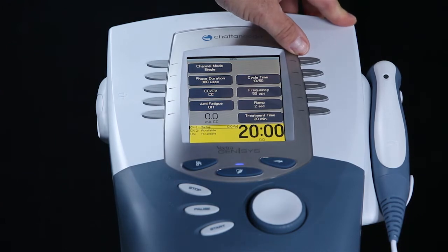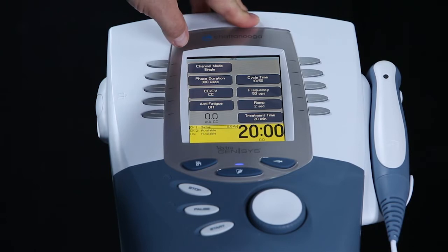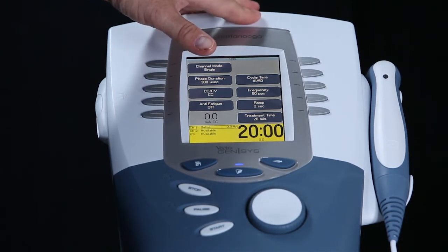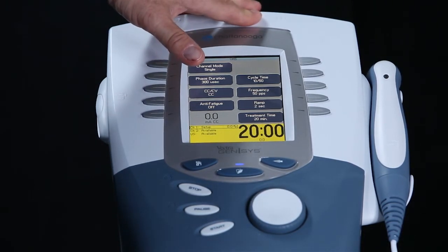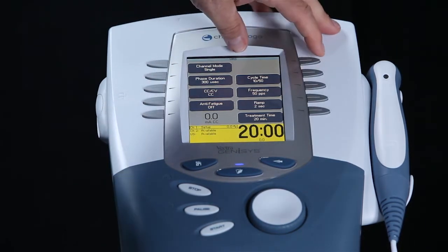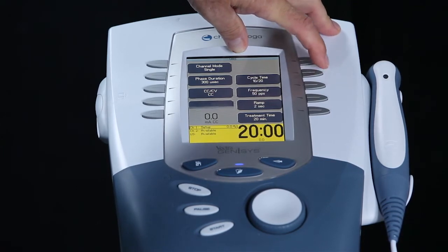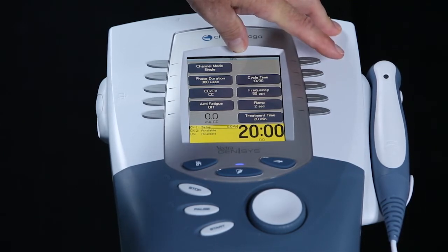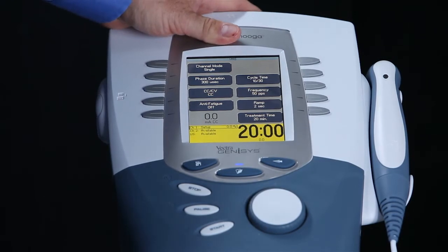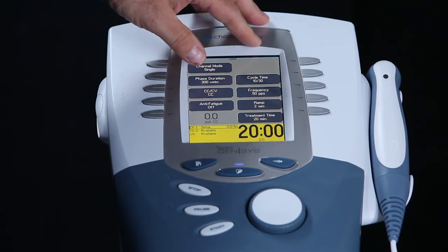Cycle time. Cycle time has an on time and an off time. It currently is set to 10 seconds on and 50 seconds off. The 10 seconds would be the contraction time, the 50 seconds would be the rest time. For our purposes today, we're going to start with 10 seconds on and 30 seconds off. As the patient gets stronger, we will shorten the cycle time or shorten the rest times so that the patient will be able to get more contractions in during the treatment.